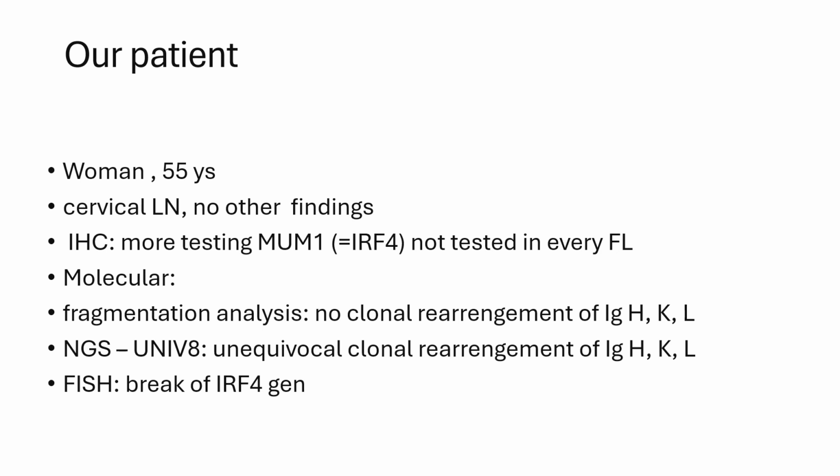So just to sum up, this is a strange case because our patient is not young, she's older, but the localization fits, its cervical lymph nodes. And actually I would like to stress this, if we see something a bit strange and not fitting, we should do more testing, like for MUM1 here. And I don't test for MUM1 in every follicular lymphoma.